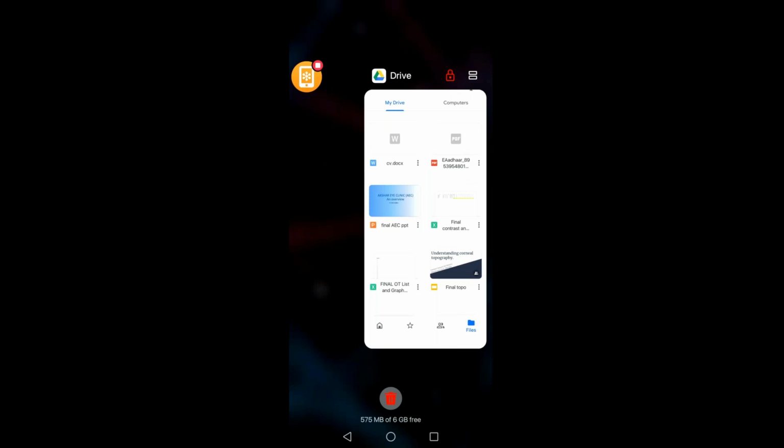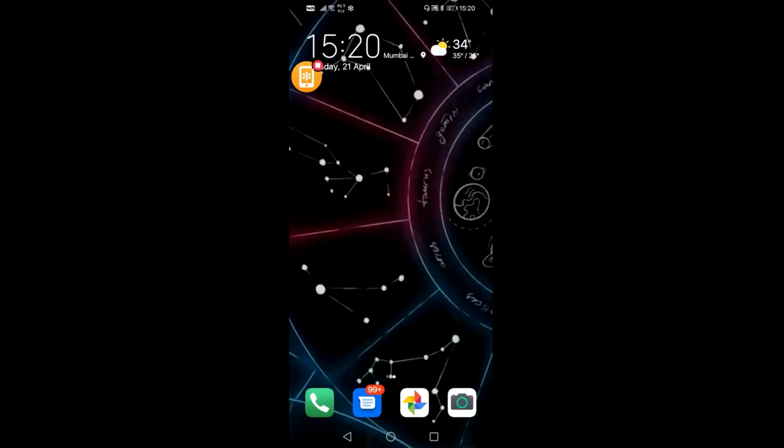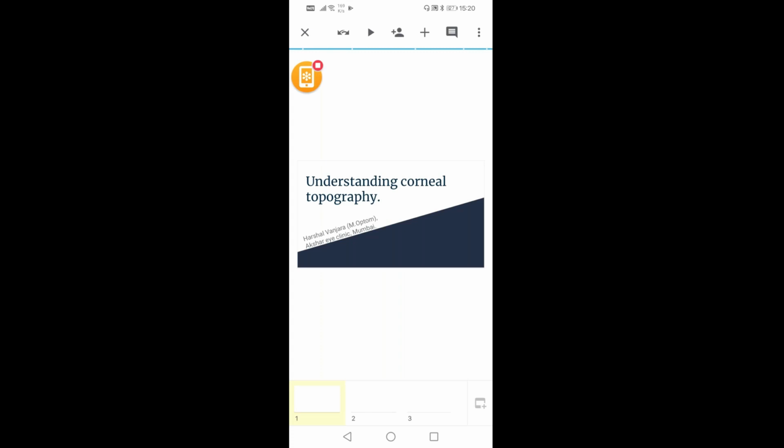Yes, definitely. Sir, there is another question from Rahul. He is asking: sir, you said that keratometric topography is so important for RGP fitting, but my question is why we need that, when we decide the back optic zone radius based on only the central corneal reading measured by the keratometry instrument. Just a moment, let me read the question on the other phone. I'm sorry, I couldn't follow you fully.